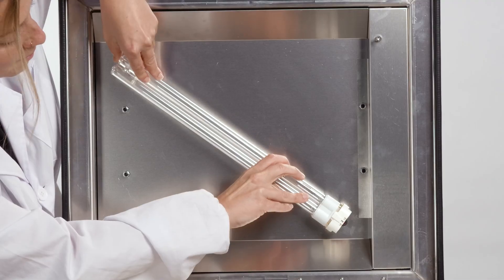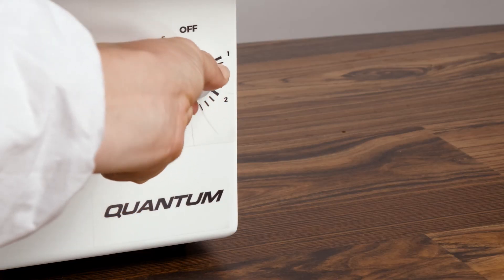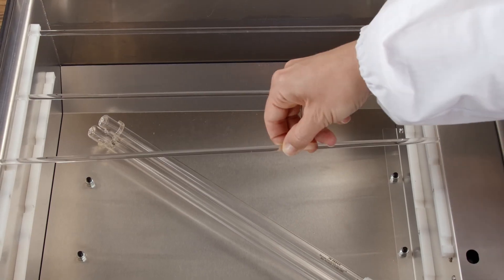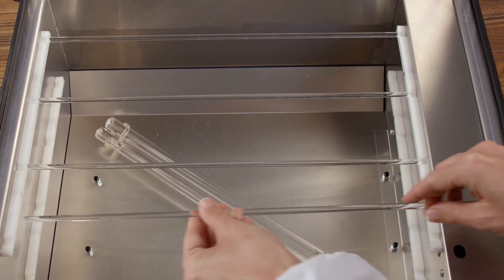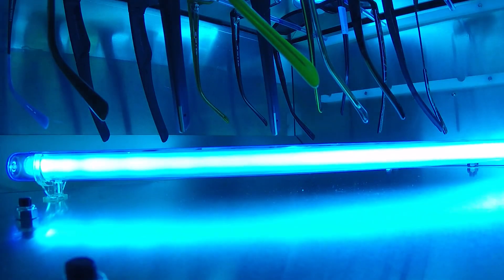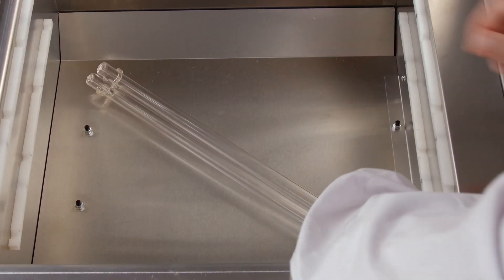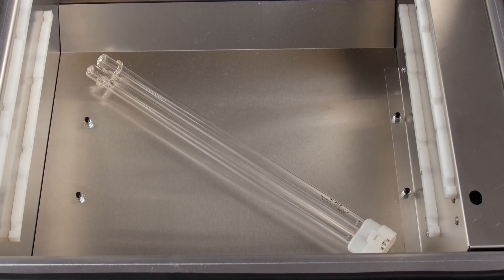Using UV-C bulb technology, the Fusion UV creates higher energy that increases the speed of sanitation. Additionally, our proprietary rods allow for light to pass through touch points and sterilize completely. The bulbs last up to 8,000 hours, or depending on usage, up to five years.